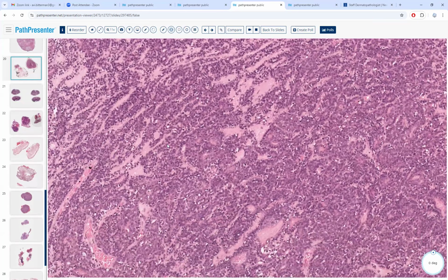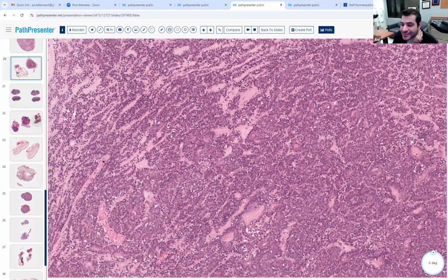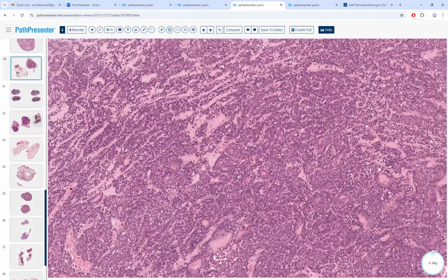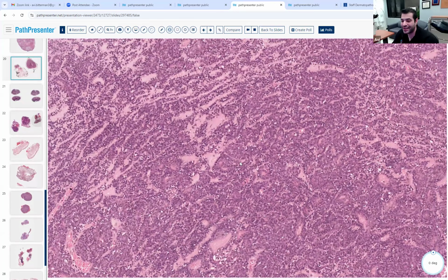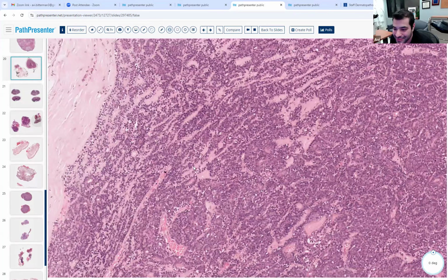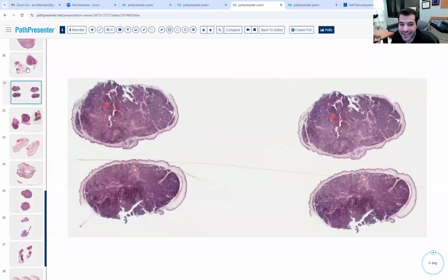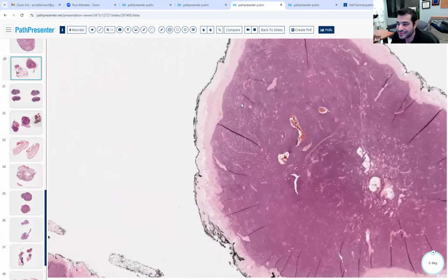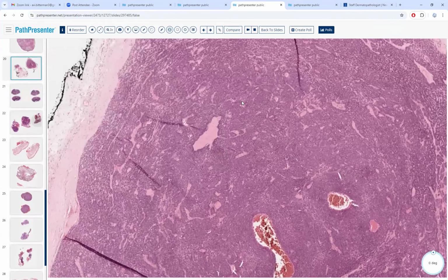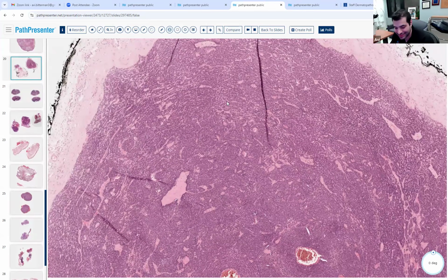Oh, is this spiradenoma? Yeah, and why'd you say spiradenoma? It's sort of like a pepper with the lymphocytes. Yeah, so lymphocytes, and anything about the stroma you're seeing? Hyalinized. Yeah, it also has that hyalinized look to it. And where do we typically see spiradenomas, by the way? Brooke-Spiegler.